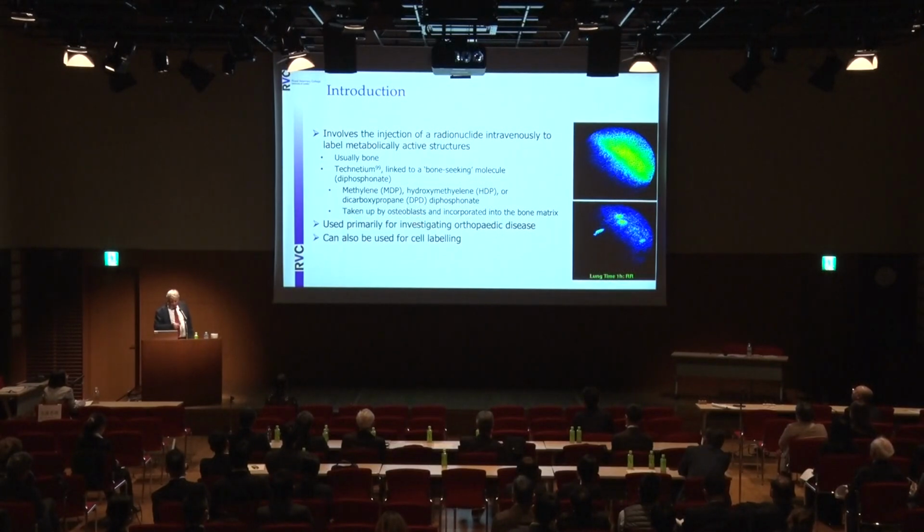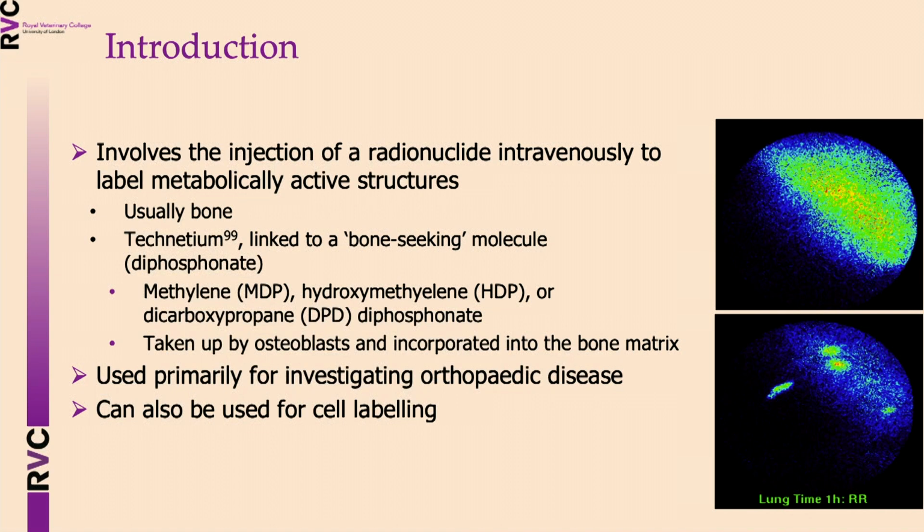So this is taken up by osteoblasts and incorporated specifically into bone matrix. And so most of the time we are using this to investigate orthopedic disease.